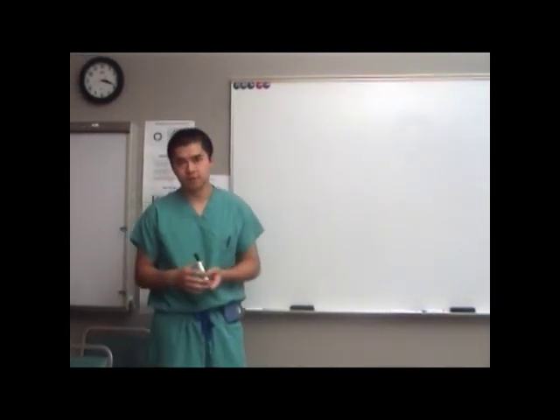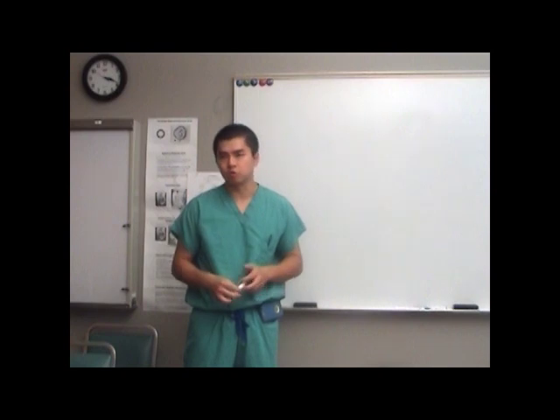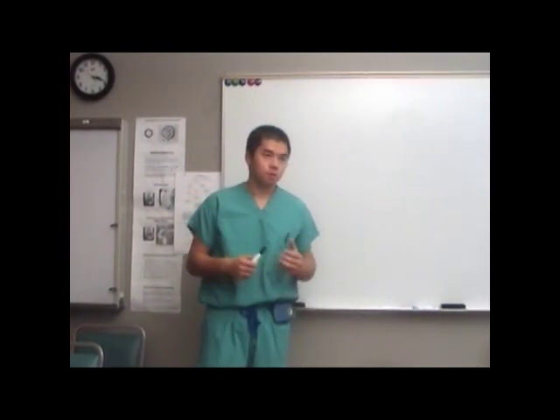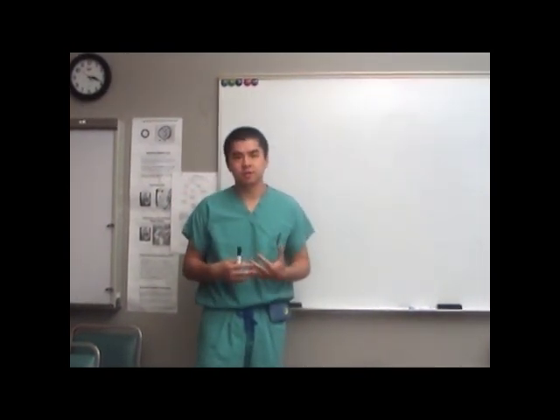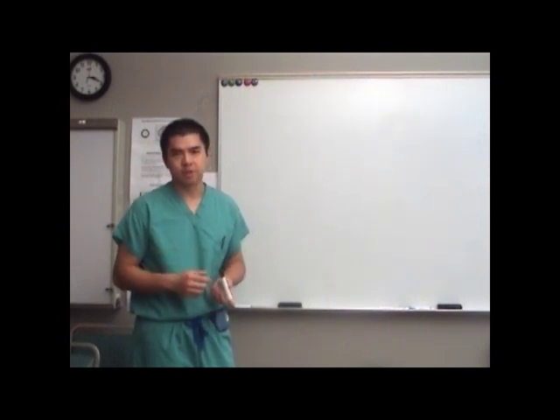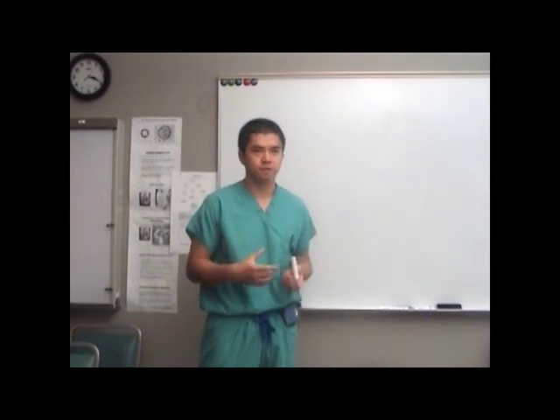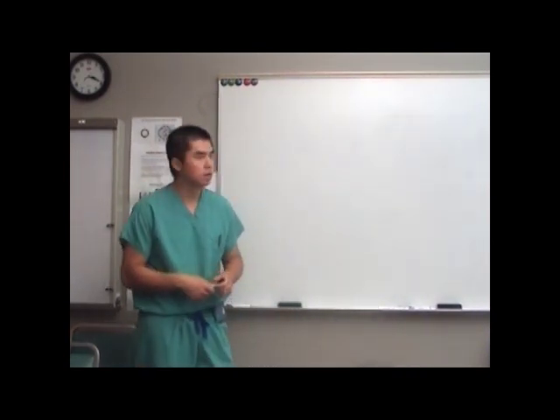The alternative is to do intermittent fetal monitoring, which is cumbersome, and sometimes facilities and staff aren't equipped to do it. So we're kind of stuck with it. It's the world we live in. Unfortunately, whether you agree with it or not, you just have to learn the terms and be able to manage patients based off of it, because that's the standard of care that we use to manage labor.